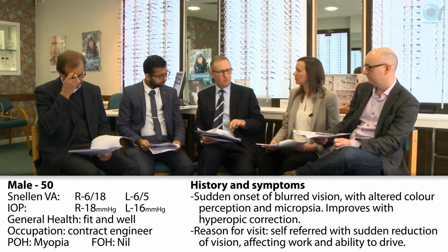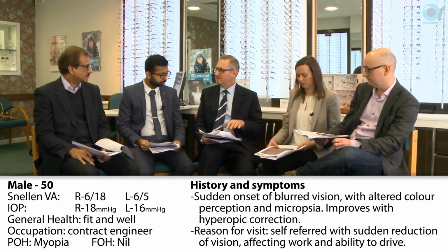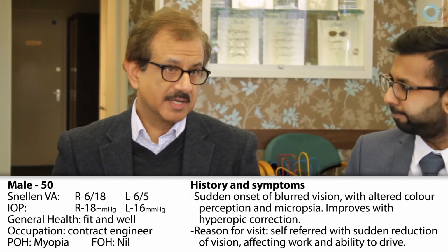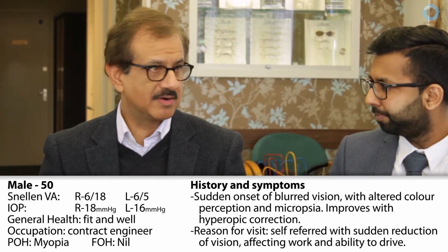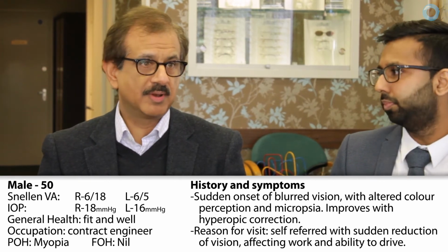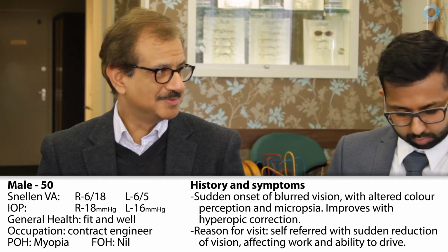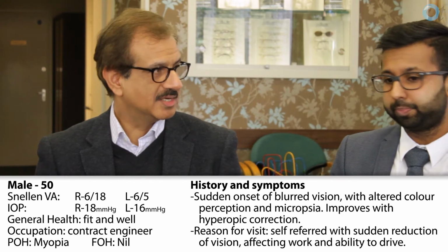Well, we know that this patient's acuity is improved if we give them a little bit more plus. Would anybody prescribe on a temporary basis to allow this patient to cope better? Having looked at some diagnosed central serous retinopathies in the past, their resolution time seems to vary. It does. So based on that, it would depend on how desperate that person was for a resolution. My feeling would be not to prescribe anything unless it was made to, because of circumstances or work, knowing that this prescription will change again in the short term.